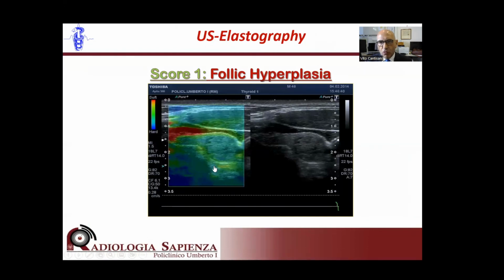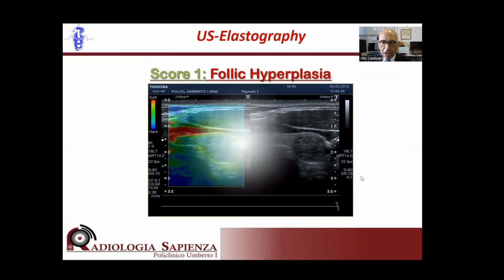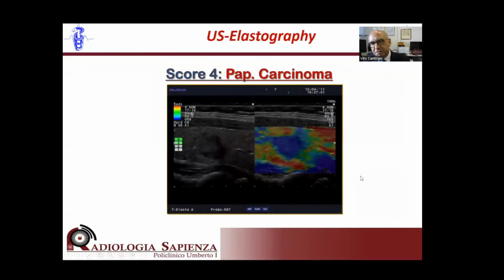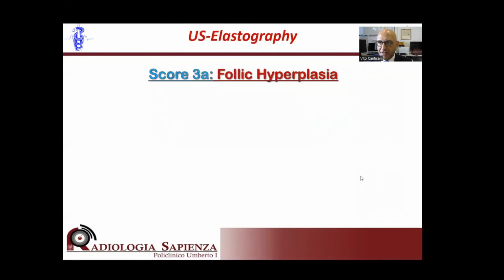Typically, when a lesion is benign-appearing at the baseline, it is completely elastic at elastography. Look at the color and the corresponding feature. It is clearly, easily characterized as benign. Vice versa, conversely, when it is very worrisome and it is very stiff, it is clearly characterized as malignant.